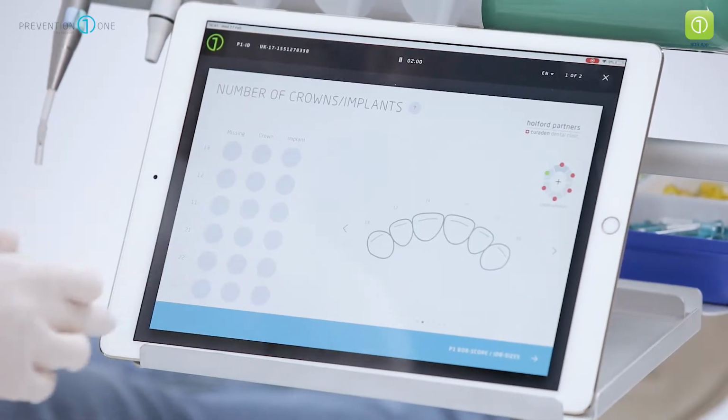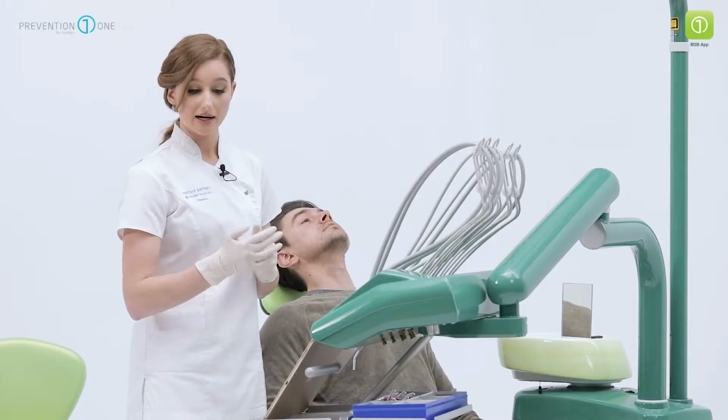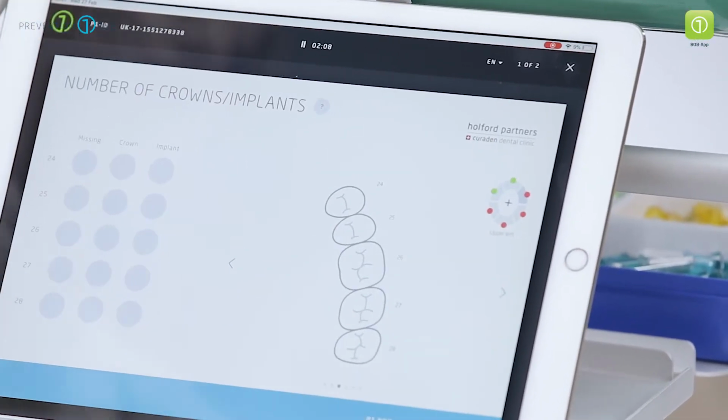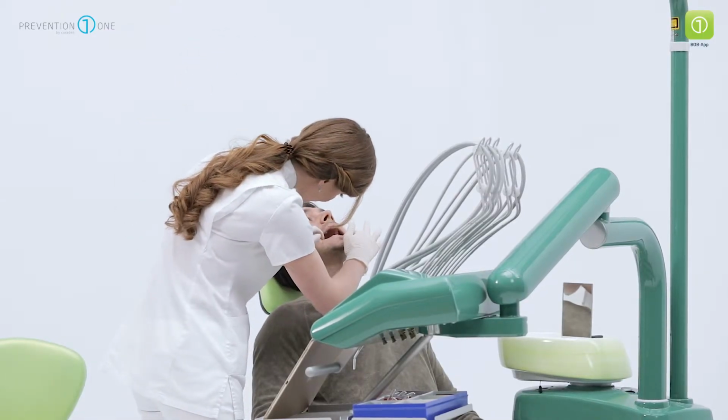Moving on, we can actually click or swipe to the next sextant. And again, you will notice in the top right hand corner what sextant you will be working on. It will also indicate a dark grey, which will indicate that's the sextant you are working on. Let's have another look here, John.